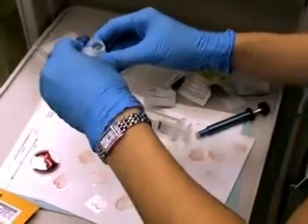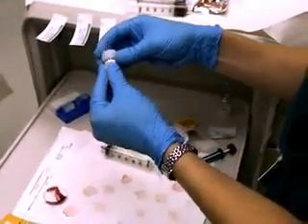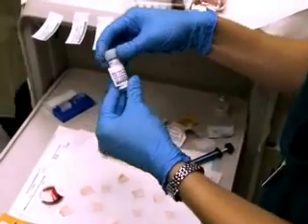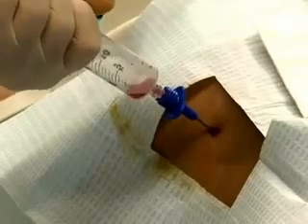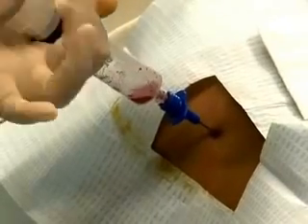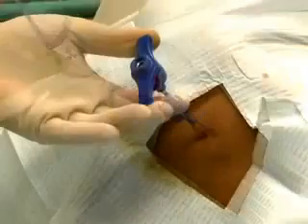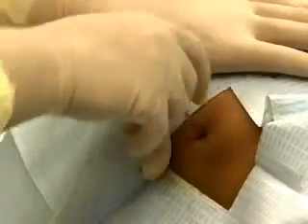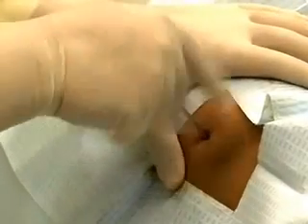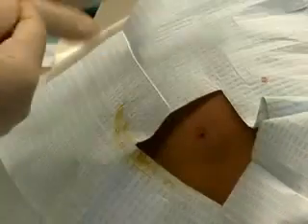After the touch prep, the bone marrow biopsy specimen should be placed in a proper sterile specimen container. A bone marrow aspirate and biopsy are useful tools in assessing a variety of hematologic, oncologic, and other disease processes that may involve the marrow space. Attention to detail and care for the patient can yield valuable information that is not available by routine blood studies.